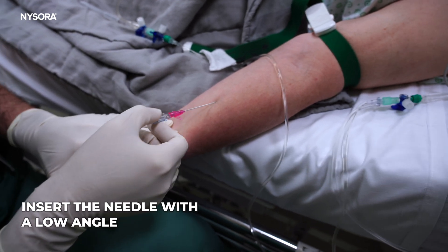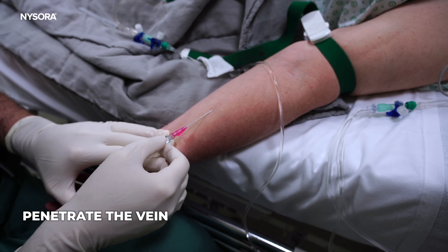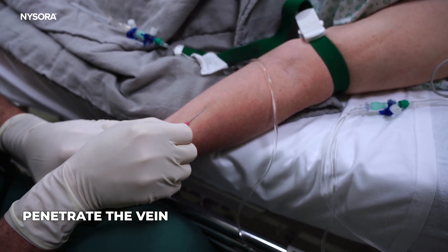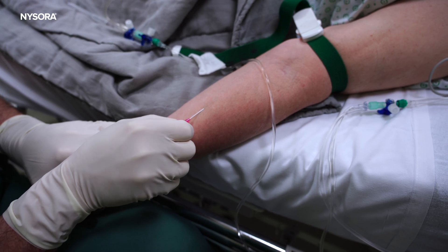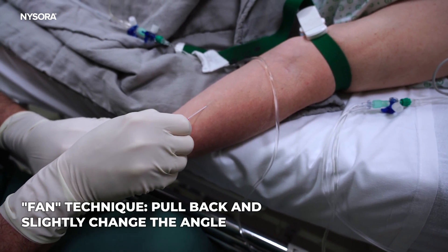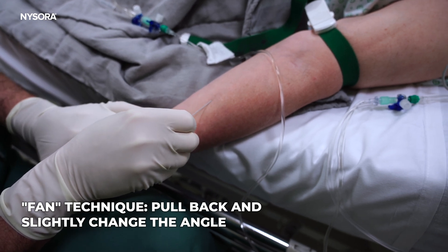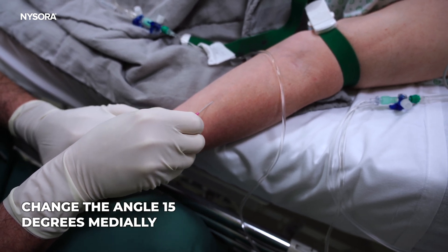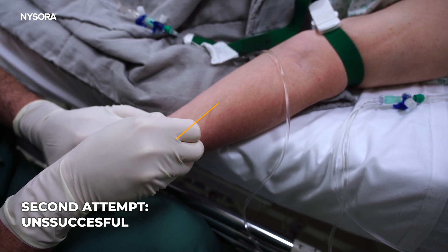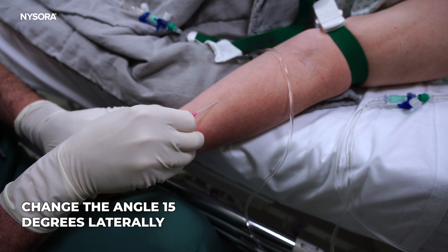We're going to first insert, then try to penetrate the vein. This angle of insertion is unsuccessful, so we're going to pull back and slightly change the angle and advance in a slightly different angle to see whether we can cannulate it. We did not hit the wall, so we're going to change the angle again in a different direction.